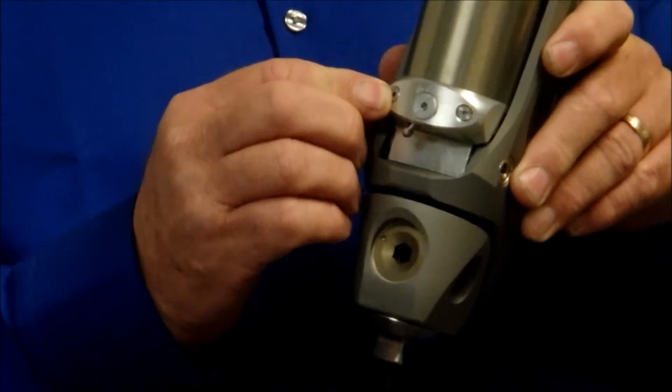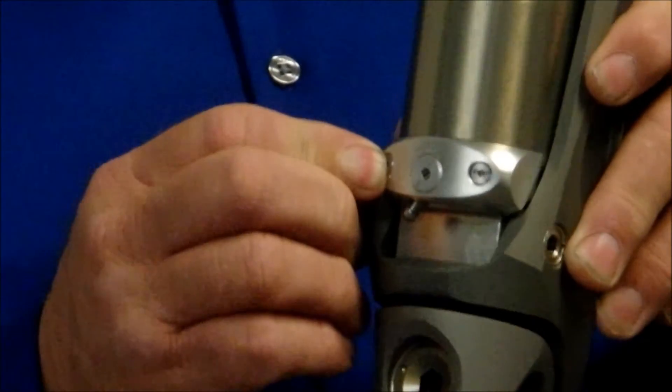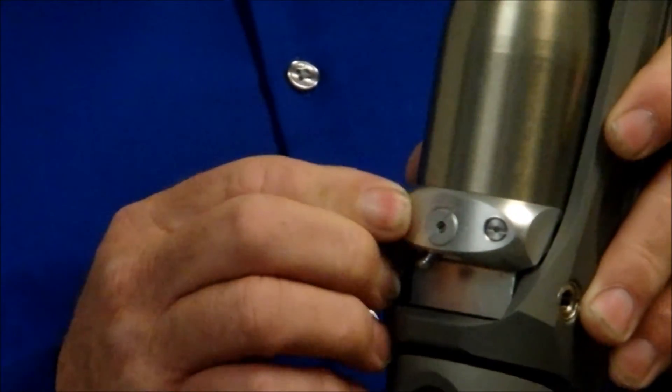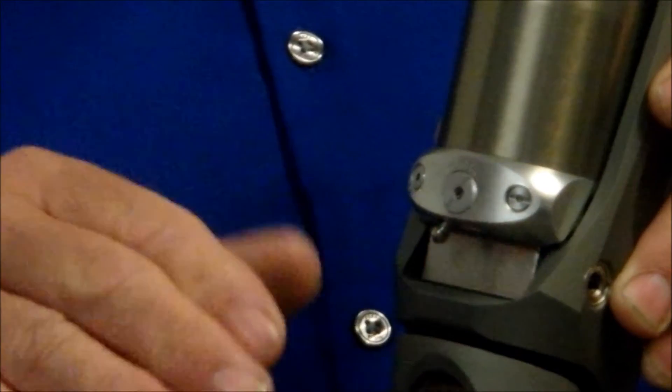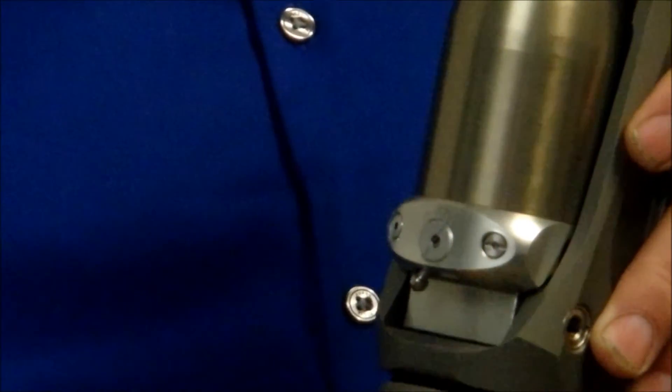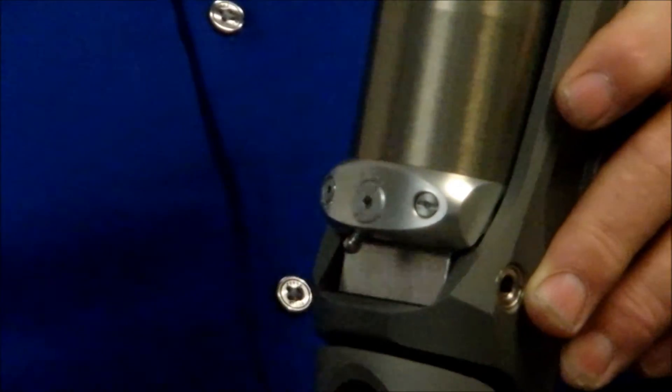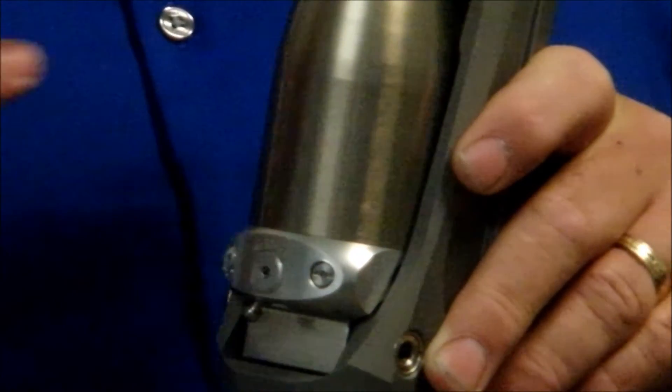We have a yield just like on an S&S knee, very similar to an S&S knee in the sense that you adjust the yield. I like to start off with adjusting the yield sitting down in a chair, much like most of the knees do, because this is a stance by default knee.